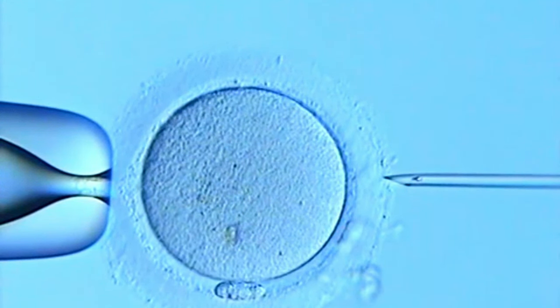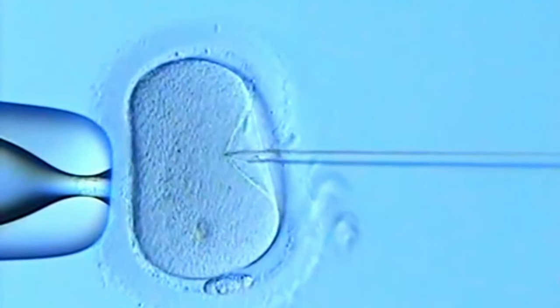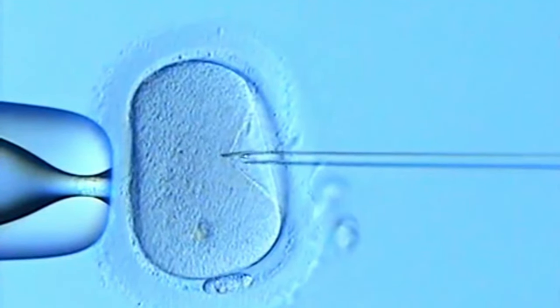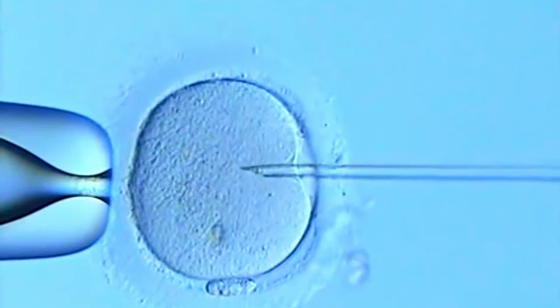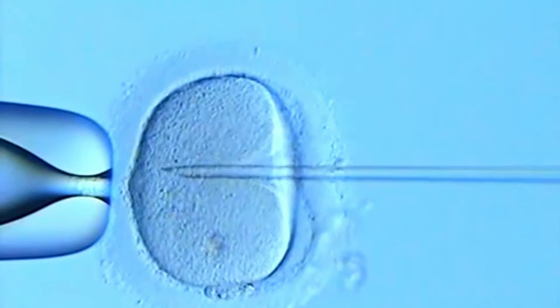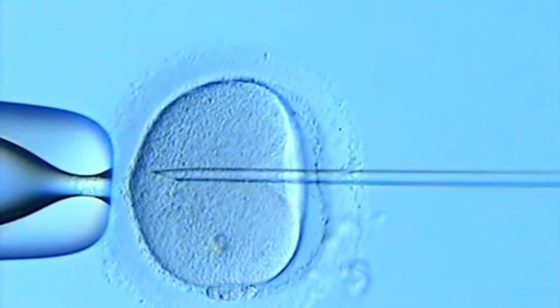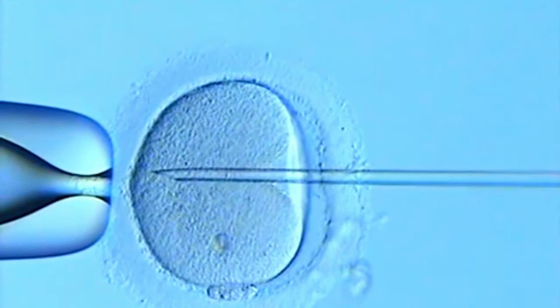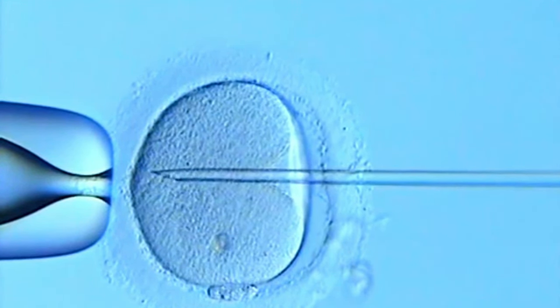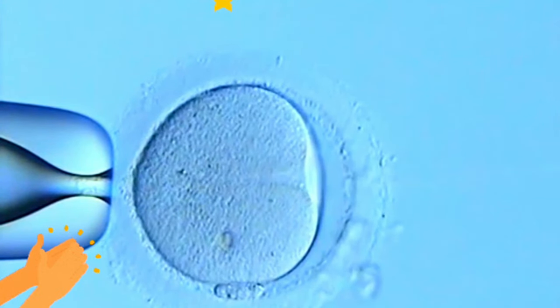Now they're getting a sperm at the tip of the needle, and then they poke through the egg, and then once the oolemma breaks, they pull the fluid into the needle, and then they inject the sperm into the egg. And then they very carefully remove the needle out, and that was perfect.